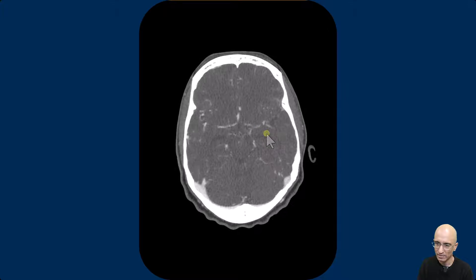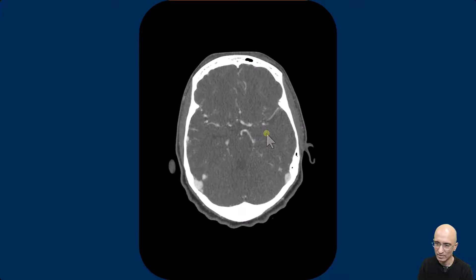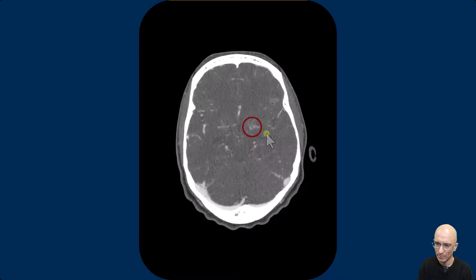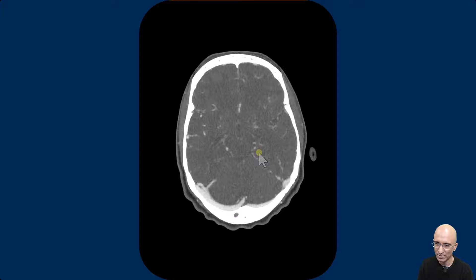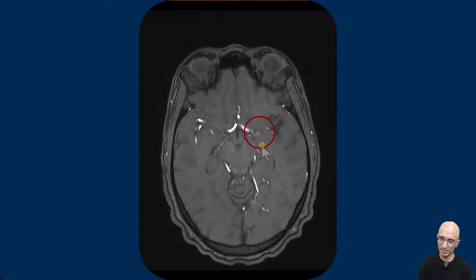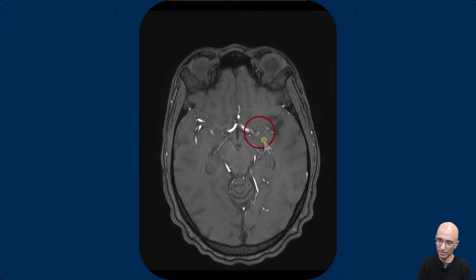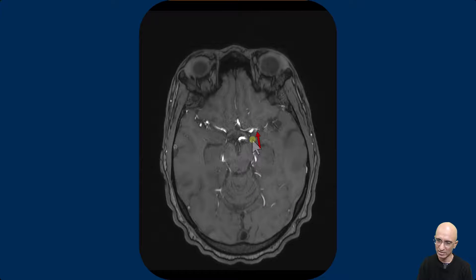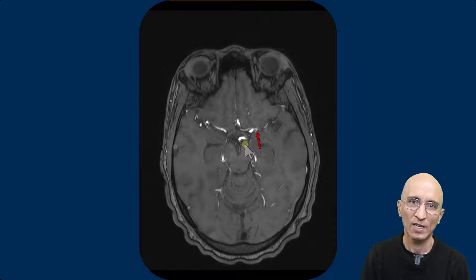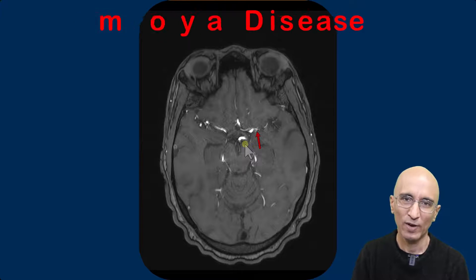As I scroll further, you can see a number of collateral vessels in the basal ganglia region. Patient also underwent MR angiogram examination as part of the workup, and you can see a number of collateral vessels in the basal ganglia region and marked stenosis of the M1 segment of the middle cerebral artery.